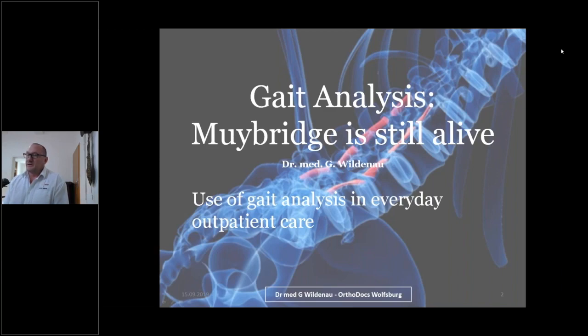What I do when I see an X-ray of a lumbar spine, we usually just get two views and say, okay, give me the computer that can extrapolate the movement and function of that structure. I think we do not have a single computer on this planet that's able to do that. All my colleagues can't do it, I can't.